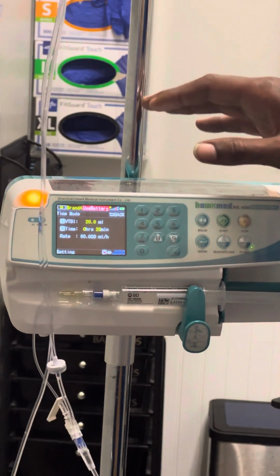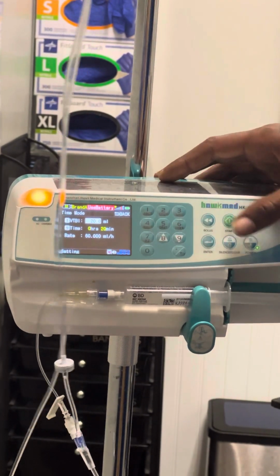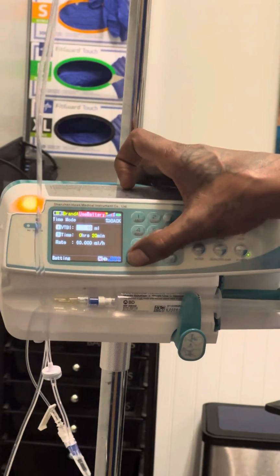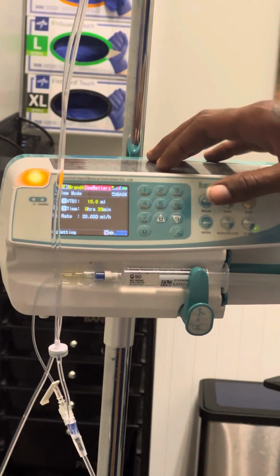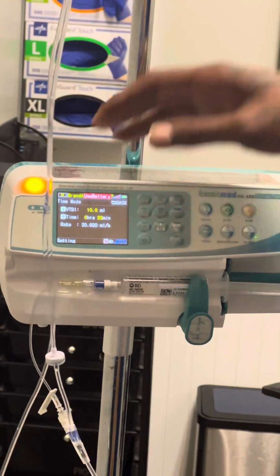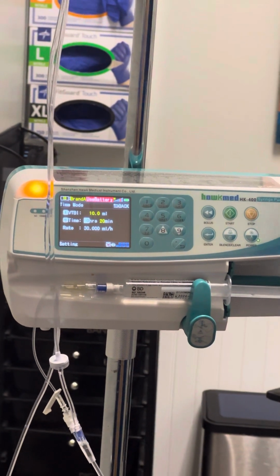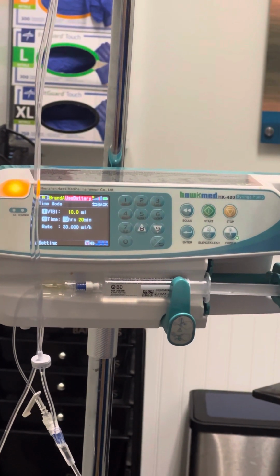Now, we are using the 10 cc syringe, so I'm going to go back and change it again. Just press 1, we hit clear. We enter the value of the volume of syringe, which is 10 ml, hit enter, that's set. Now, the time is on the number 2 designation, so I will hit 2. And generally speaking, we can do 15 to 20 minutes. I think the protocol is like 20 minutes for a lot of our pushes.